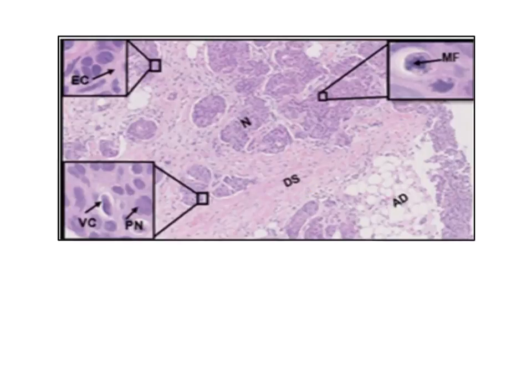An abundant eosinophilic cytoplasm, EC, along with the low numbers of mitotic figure, MF, give the diagnosis of grade 2 invasive ductal breast carcinoma, demonstrating the tumor to have some differentiation with low aggression, as signs of metastasis were not evident due to the absence of lymphovascular invasion.